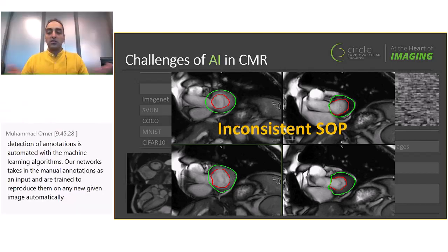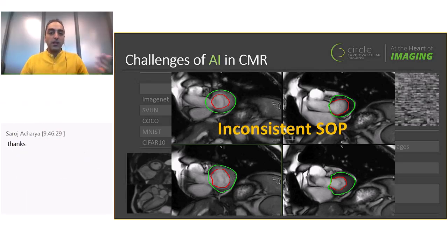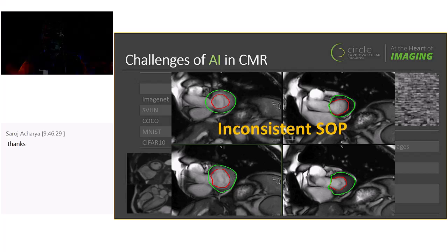Would we be able to then do a distributed learning approach to learn all the different variations in contouring and aggregate them globally somewhere, to share the benefits of the different contouring SOPs among the different users of the product? And if we were to do that, can we do analyses to figure out what's the best SOP, which one has the most prognostication power and things like that?